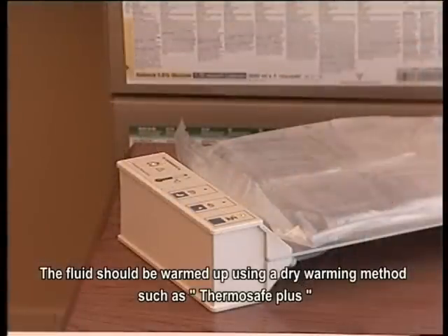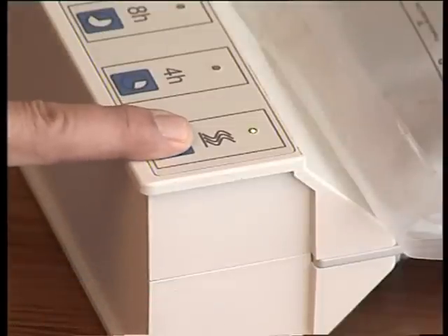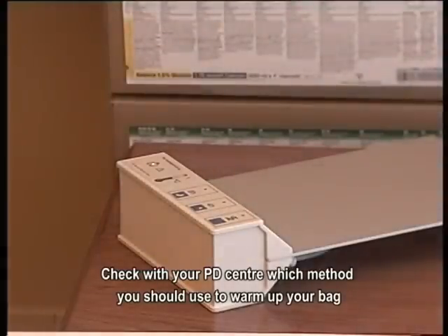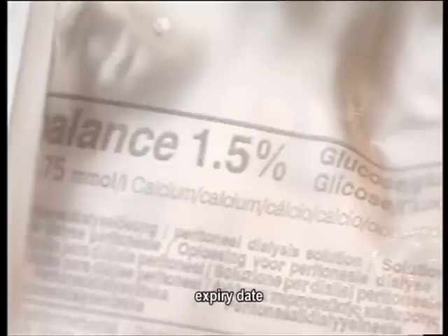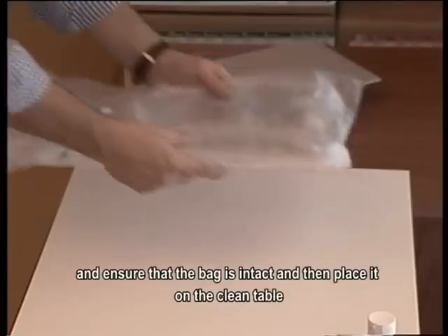The fluid should be warmed up using a dry warming method such as ThermoSafe Plus. Check with your PD center which method you should use to warm up your bag. Check the fluid for correct volume, glucose percentage, expiry date, and ensure that the bag is intact, and then place it on the clean table.